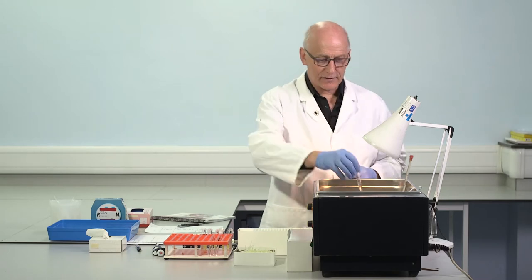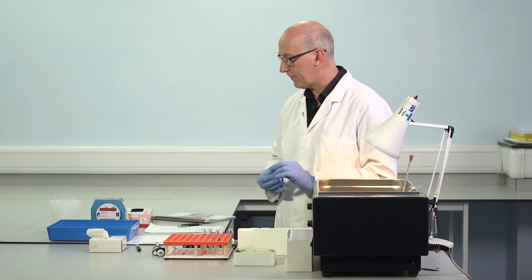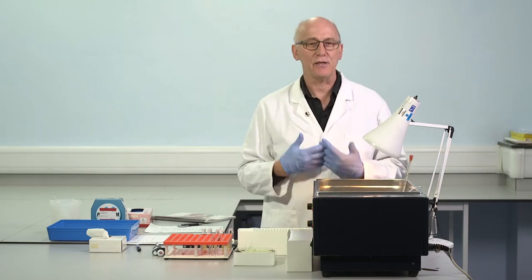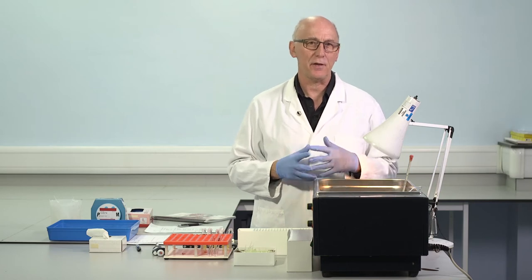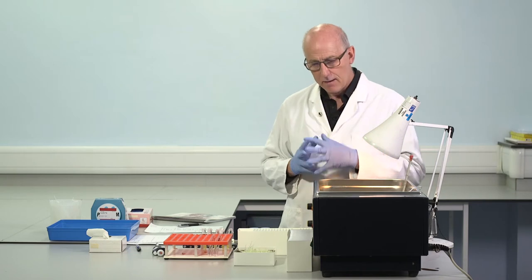So we need to leave this in at 37, so the level of water is above the level of fluid in the tube, fully immersed so that it will come up to temperature. We know that plastic is not quite so efficient a heat transfer as glass, so it will take a few minutes for this to reach 37 degrees, so we'll leave that to be warming.